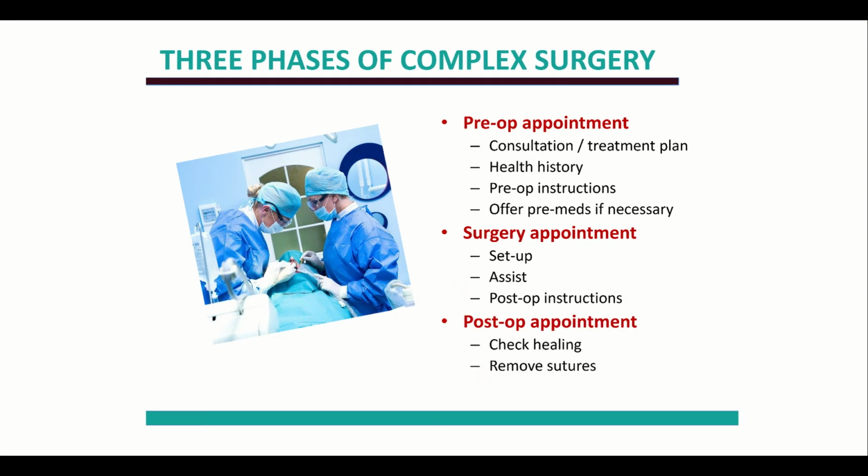And then lastly, we will pack some gauze in their mouth over the extraction site, tell them to close down, leave it in there for a couple of hours at least, then exchange it with some new 2x2s that we typically give the patient, and they should see a sharp decrease in the amount of blood flow coming from that socket.